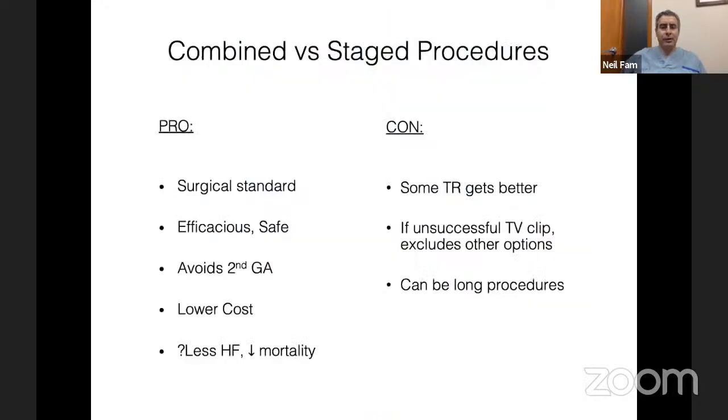There are pros and cons to combined versus staged procedures. In favor of this, it would replicate the surgical standard. It is generally efficacious and safe. You avoid a second GA in an elderly patient. At the present time, the cost is less, and there is the signal towards less heart failure and mortality.